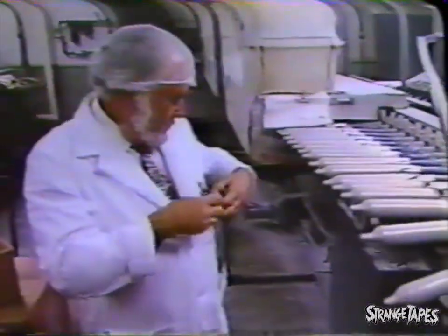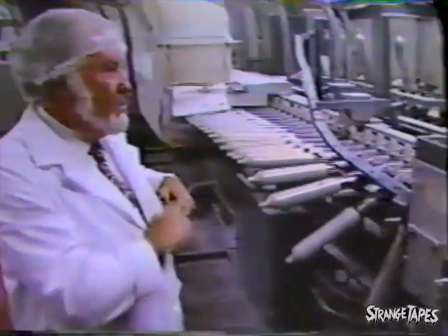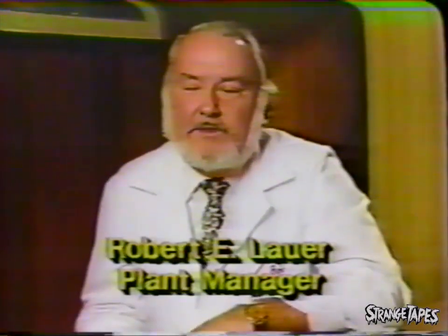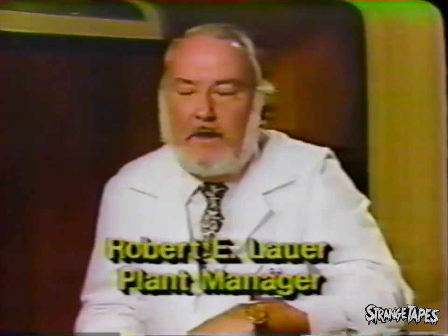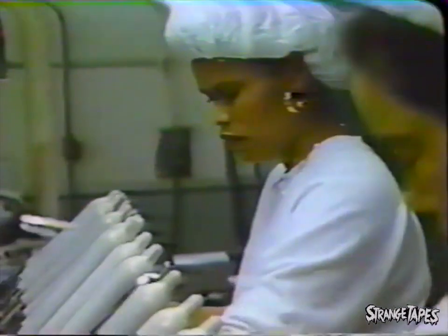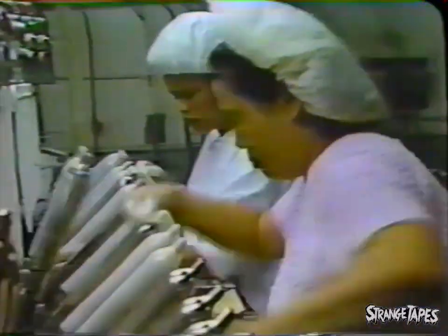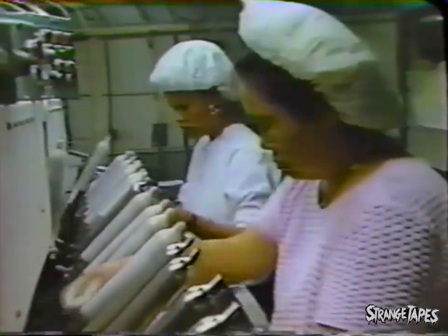Quality control and testing are of primary importance. Bob Lauer is manager of the Trojan plant. Trojan brand condoms that are manufactured here in Trenton are all electronically tested, 100%. The test consists of a condom being placed on a stainless steel mandrel that is 15% larger than the condom itself.